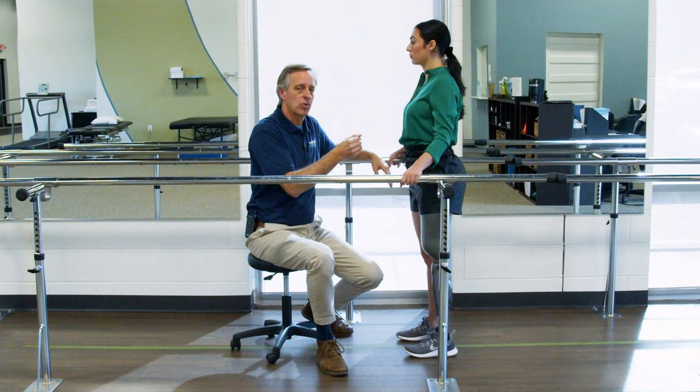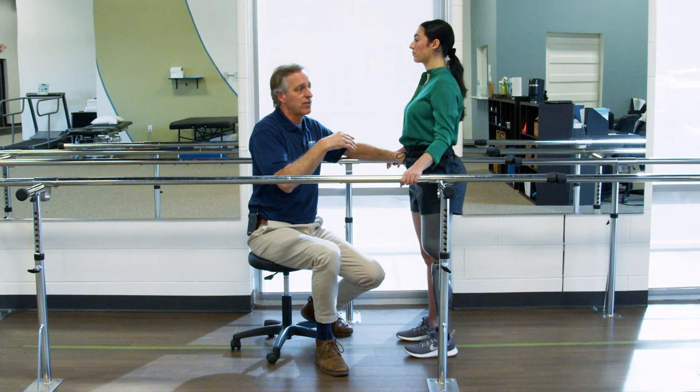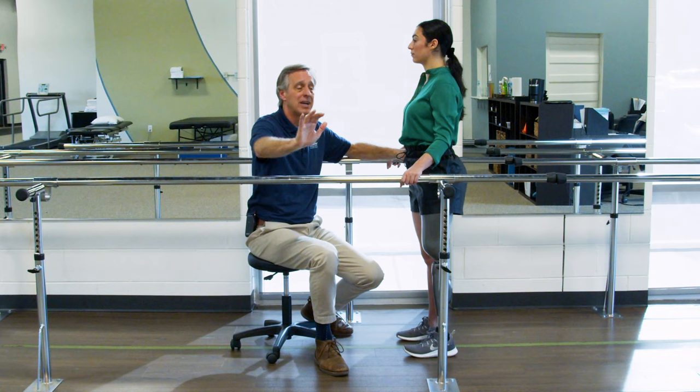I like to call this my movie theater gait, where if you're walking out of a movie theater in a big crowd, you can't just step out or you're going to step on somebody. But you've got to keep moving, right? So you've got to move fast, but you've got to keep your steps really small. And that's the same idea if you're walking on a slippery surface. I need to step and keep my foot down flat, not land out on my heel, or my heel might slip out from under me.